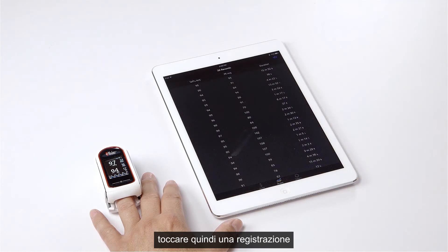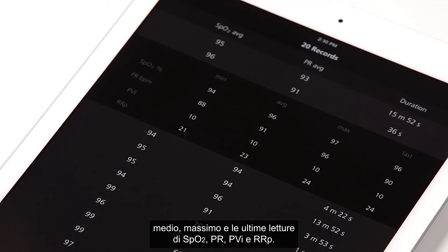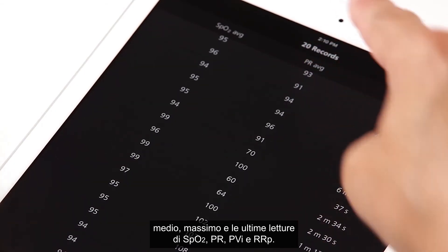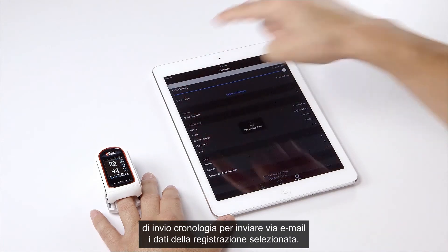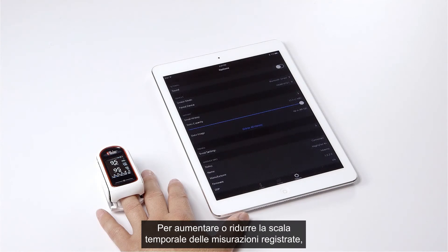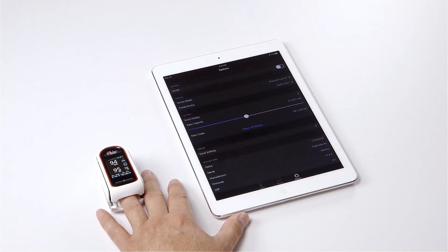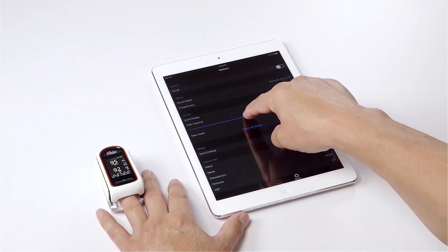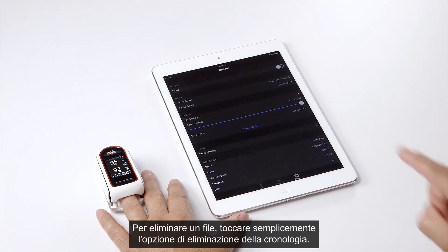Tap on any individual record to see additional detailed information, including minimum, average, maximum, and last readings for SpO2, PR, PVI, and RRP. Tap the options icon and tap email history to send the data of the selected record via email. To increase or decrease the timescale for recorded measurements, swipe the blue slider to change the data capacity. To delete any file, tap on delete all history.